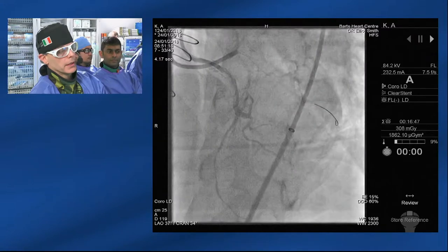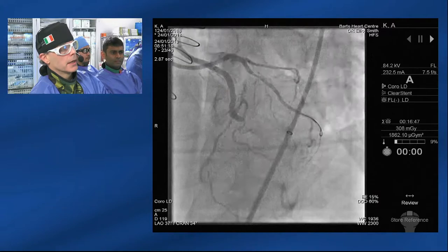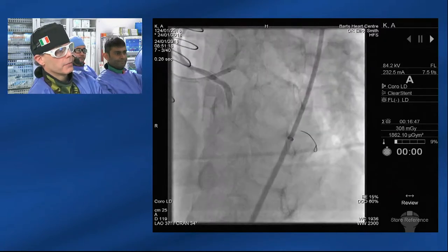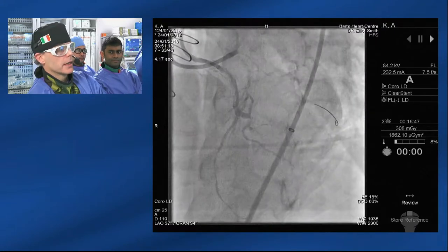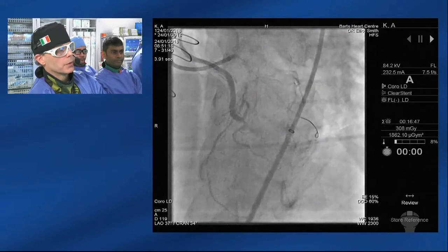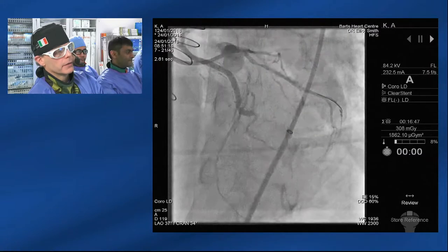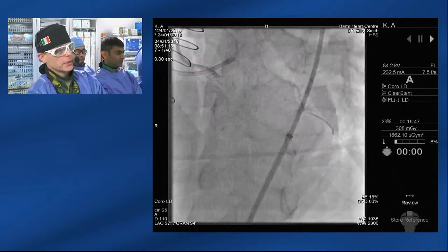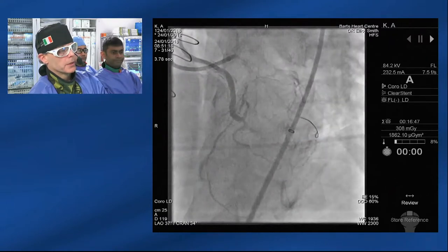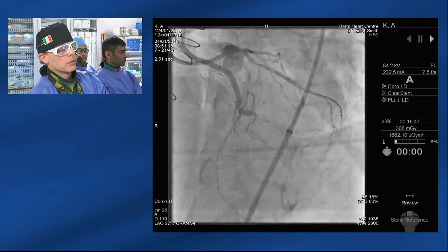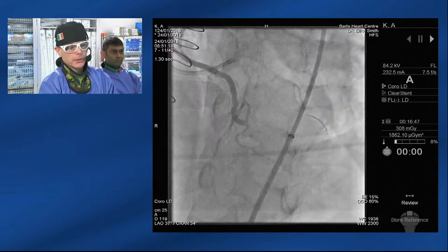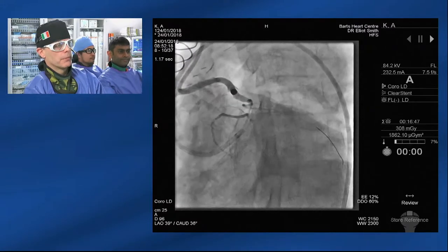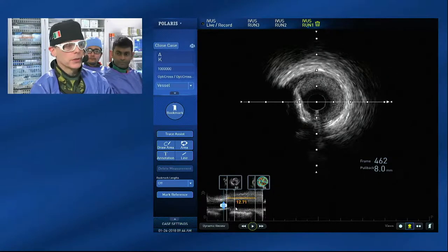If we take that as an antegrade case only — yes, that's feasible antegradely — but what makes it difficult and more likely to be a sub-intimal case, which we've solved by dissection re-entry, is the angulation and the calcium. We're going to require a fairly high penetration force to deal with the proximal cap. The ideal scenario is to create a connection within the CTO body itself, protecting all the branches. We'll do an IVUS run to see if we can clarify where the proximal LAD cap is.